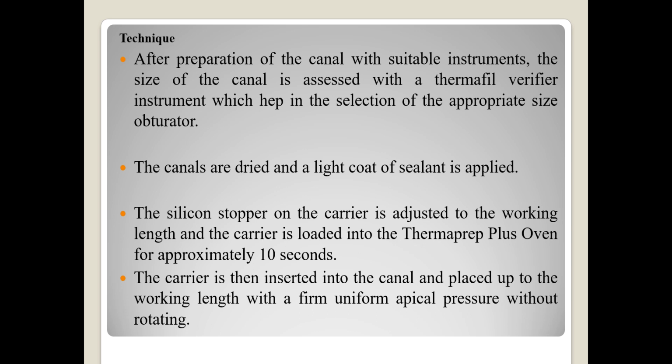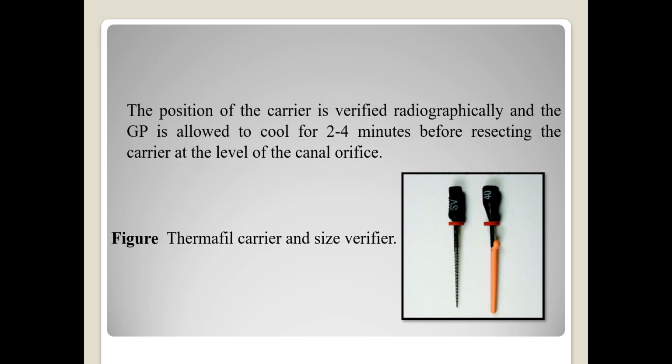The carrier is then inserted into the canal and placed up to the working length with a firm, uniform apical pressure without rotating. The position of the carrier is verified radiographically, and the GP is allowed to cool for 2 to 4 minutes before resecting the carrier at the level of the canal orifice.